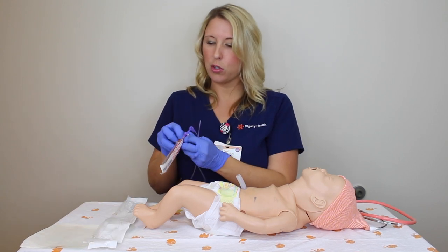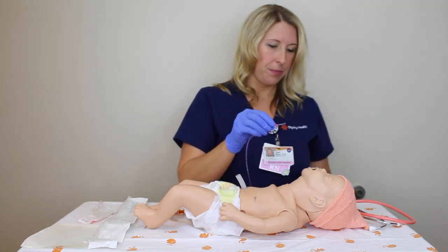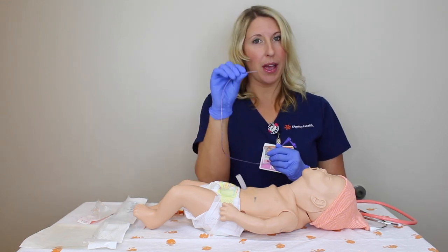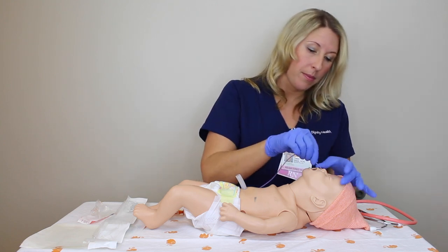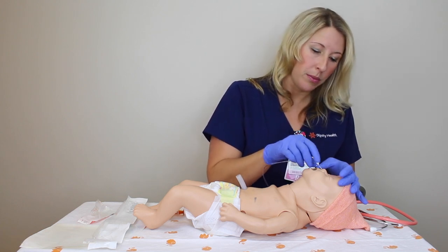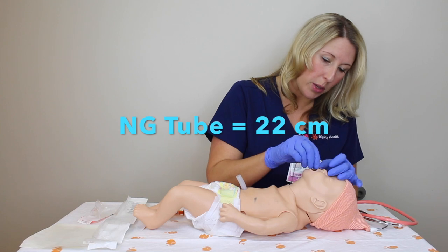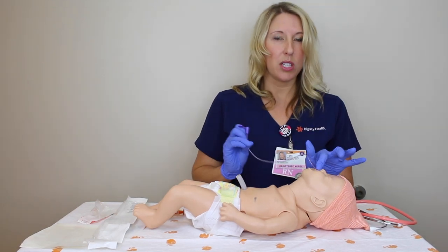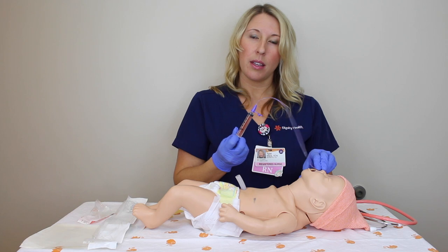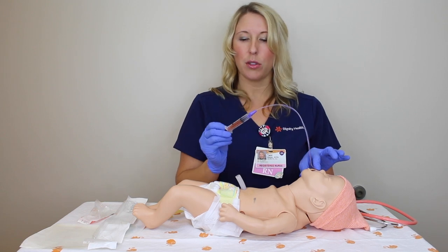Take your tube and have your syringe ready in case placement is confirmed. You may use lubricant on the tip of the tube to help it pass more easily through the nares. Slowly advance the tube — if there is resistance, do not force it. Keep passing the tube until you reach your measurement of 22. When 22 is at the nares, hold it with your finger, take the syringe, and slowly aspirate the stomach contents. When you receive gastric juices or feeding, you know that you're in the right place.